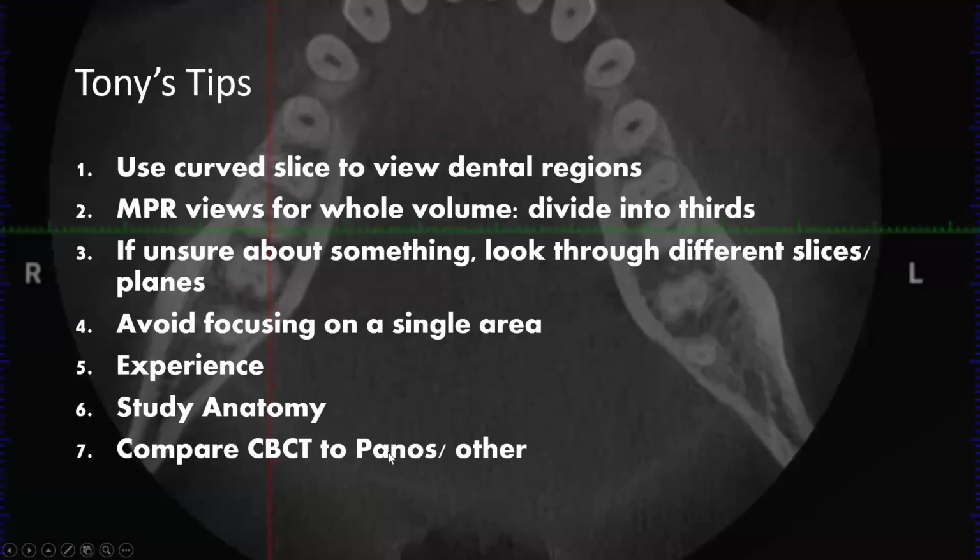This is where I learned a lot, was comparing to other radiographs. This is why it was advantageous, I think, early on to be able to work at a school, and I can do the same thing here. If I see something that doesn't make sense, and I think maybe the pano will show that better, I can look up the patient's pano and compare that. And really early on, that was helpful for helping me learn what I'm looking at, what I'm seeing.